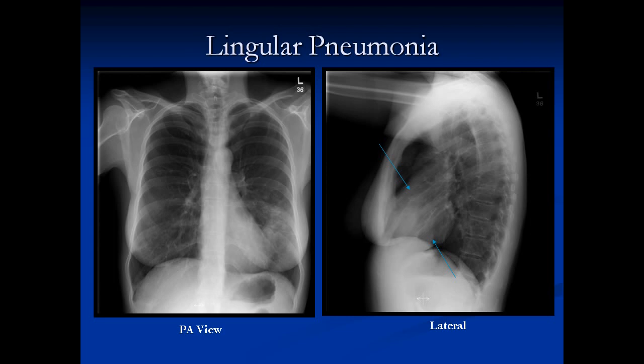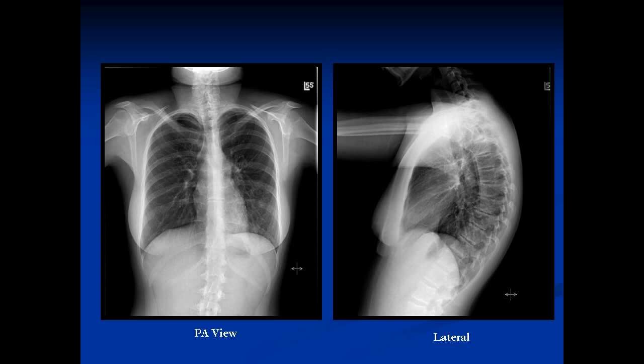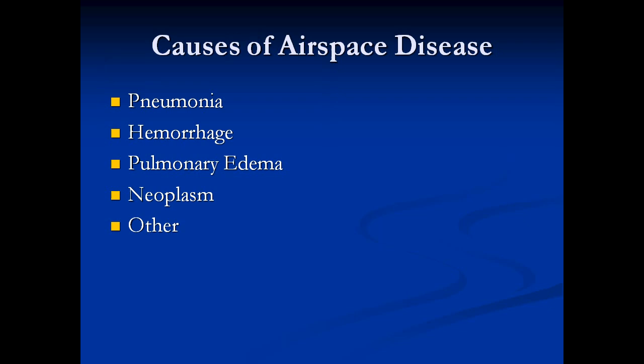Sometimes it's difficult to see on the lateral view, but on the PA view, if you don't have the heart border, then there's consolidation in the lung. What border is missing here? We can see all the borders on the PA view. On the lateral view, we have the right diaphragm going all the way to the front and the left diaphragm stopping at the heart, but we can't see the posterior aspect of the left diaphragm — this is a left lower lobe pneumonia. Going down the spine, it should get blacker but instead it gets whiter, and that's where the pneumonia is.